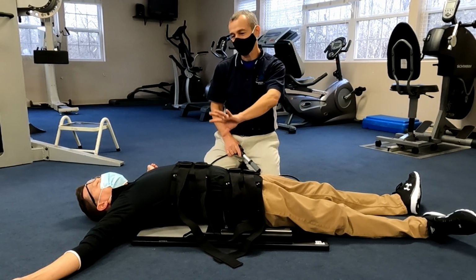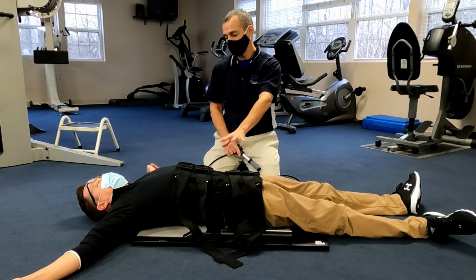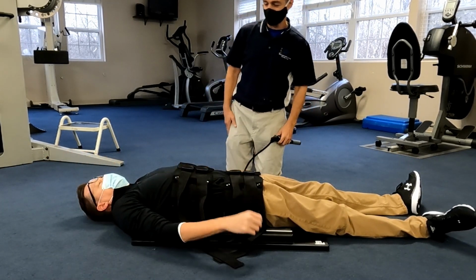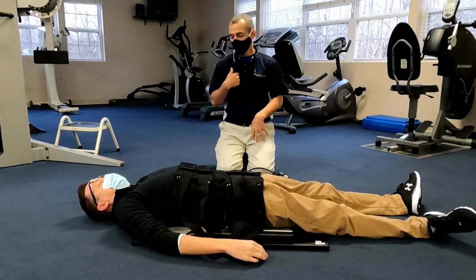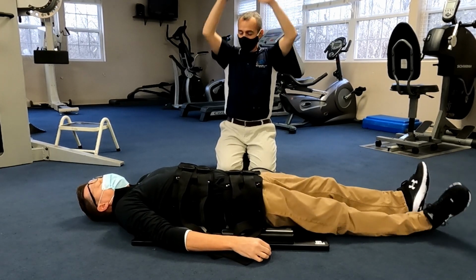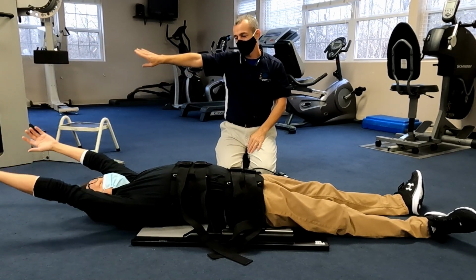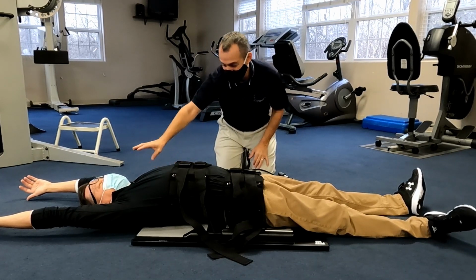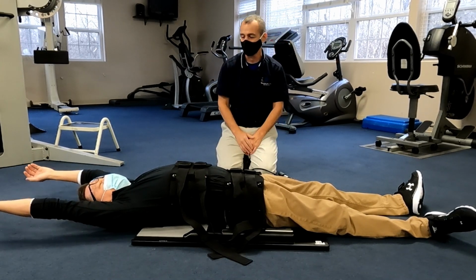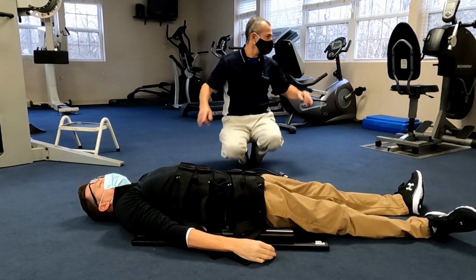Depending on the client's preference for lumbar flexion or lumbar extension, let's say you do better in this extended position. Let's bring the hands down by your pockets. And what I want you to do for me is, as you breathe in, bring the hands up overhead. Keep them about shoulder width apart. So go ahead. That's it. All the way up. So that is going to engage the lats, which are going to pull into that thoracolumbar fascia. And then as you breathe out, the arms come down. Let's do one more just like that.